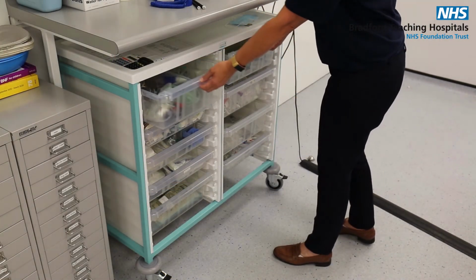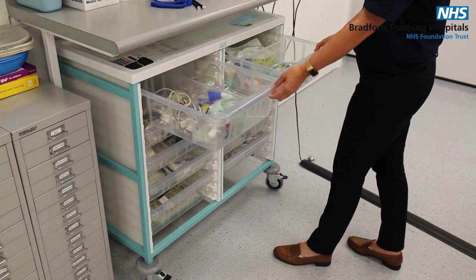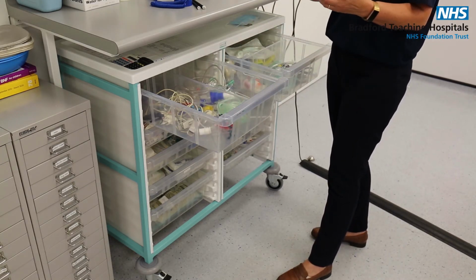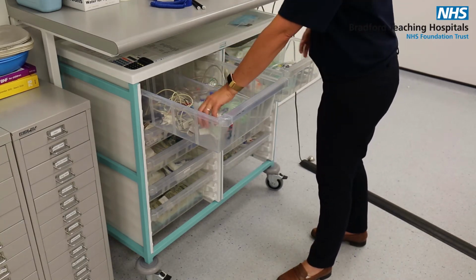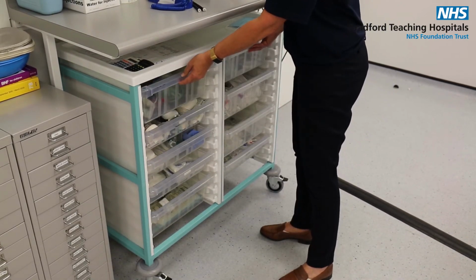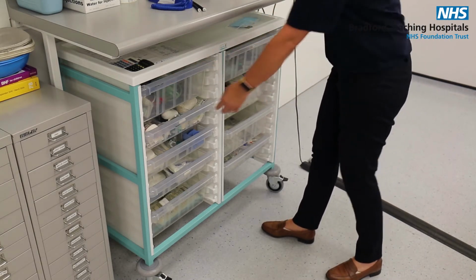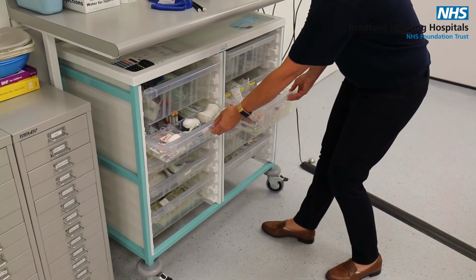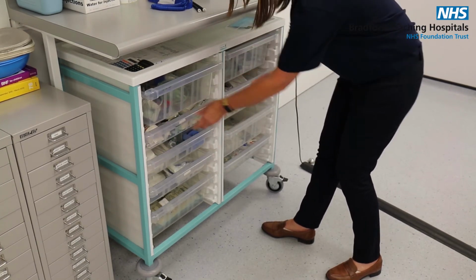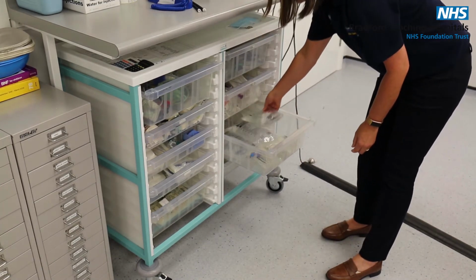In this trolley, the majority of consumables you will be required are stored. You will notice that the majority of this equipment is out of packaging and possibly out of date. Please do not worry about this, as we reuse all equipment and the majority of our supplies is out of date stock from wards and departments. The top two drawers contain airway and oxygen equipment, and the second drawer contains blood bottles, syringes and cannulas. Third drawer are IV fluids.